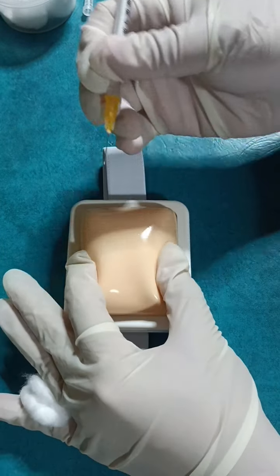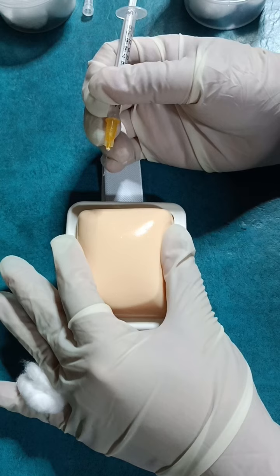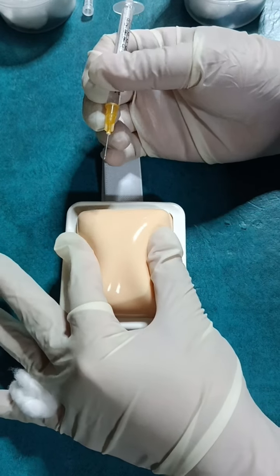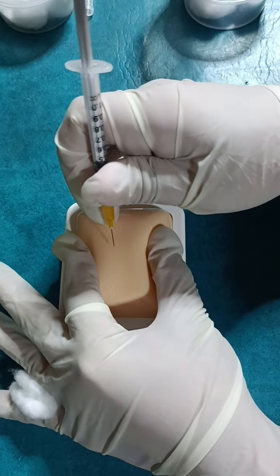Let's say that the patient is thin, then we will pinch the skin, and then we will inject at a 45-degree to 60-degree angle.